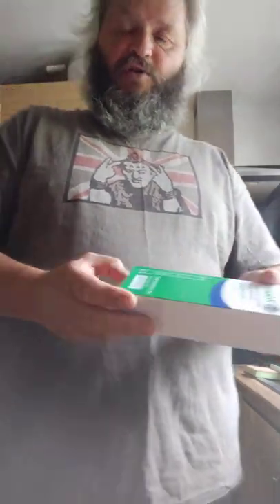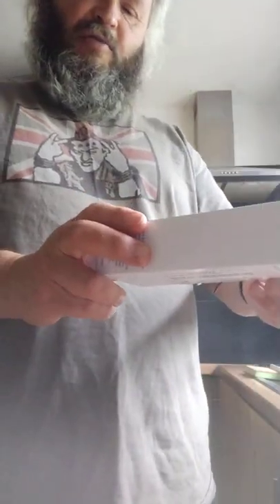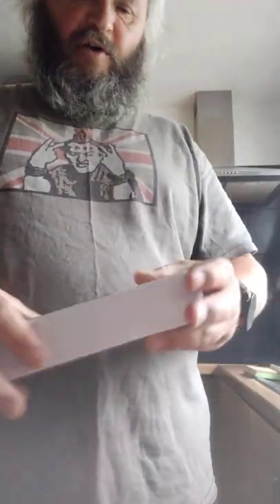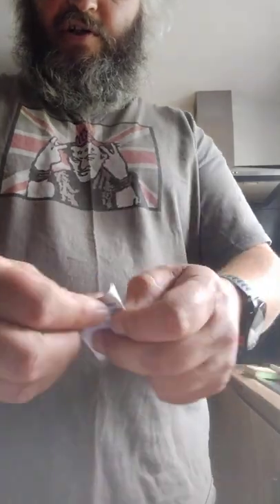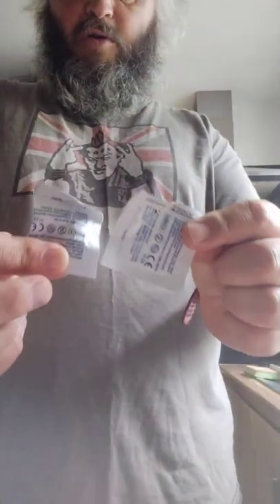Each packet contains two subcutaneous single-use pre-filled pens. So we just open it up and inside the pack we have two injections, a couple of alcohol wipes, and a whopping great big instruction manual — but hopefully you'd already been shown how to use it.